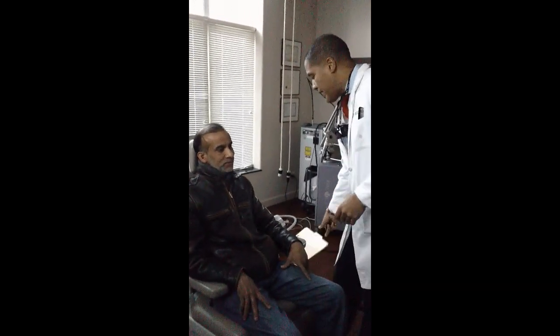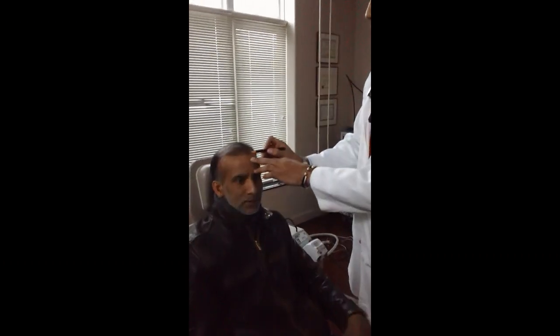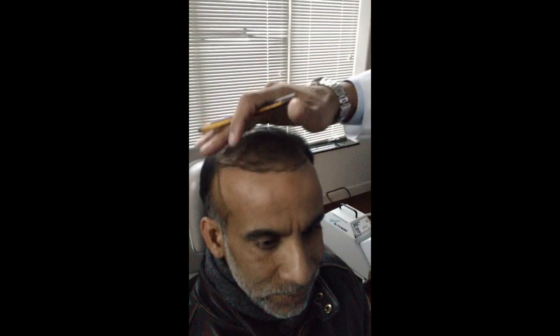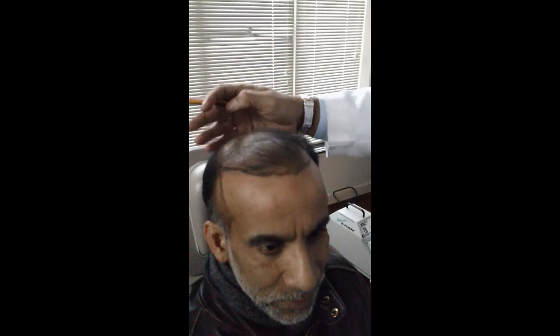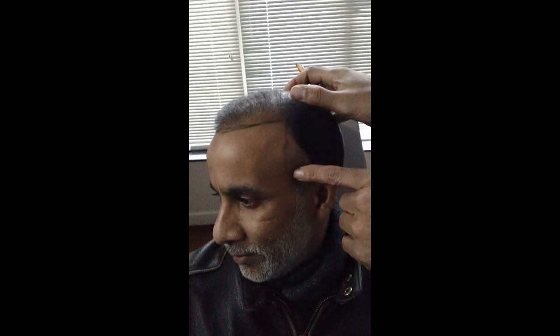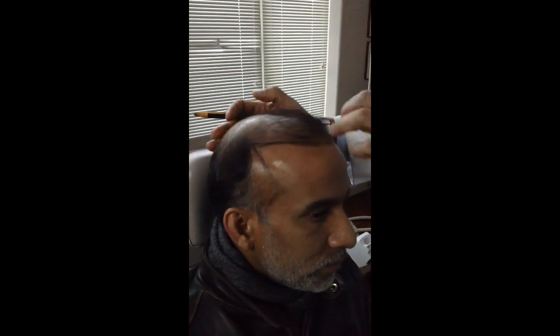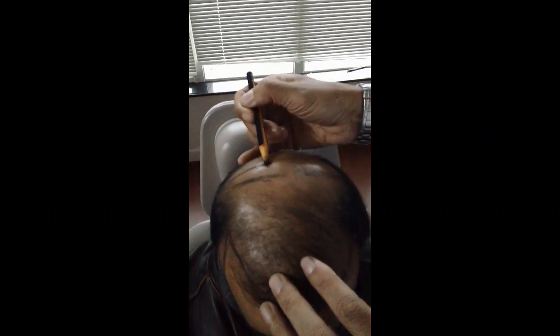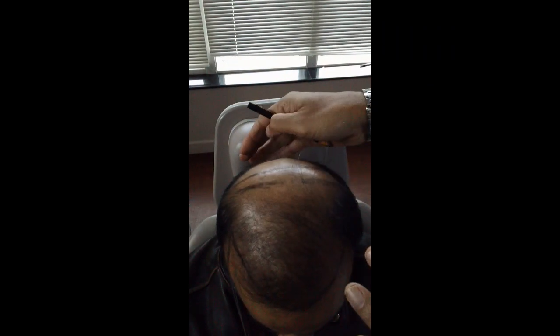And what we've worked out here, if you come in with the camera, is to thicken this area in the frontal area. You always want to maximize the front of the face before you go in the back, okay? So we're going to thicken this whole front and mid scalp. We're also going to pull out his temples a bit here. You can see his temples are a bit washed out, so we're going to bring that out. Same on this side. Thicken this front and mid scalp, and hold your head down here, and end up here at what we call the vanishing point, where if you take your finger from the front, this is as far back as you can see from the front, where his head starts to dive down into that descent.